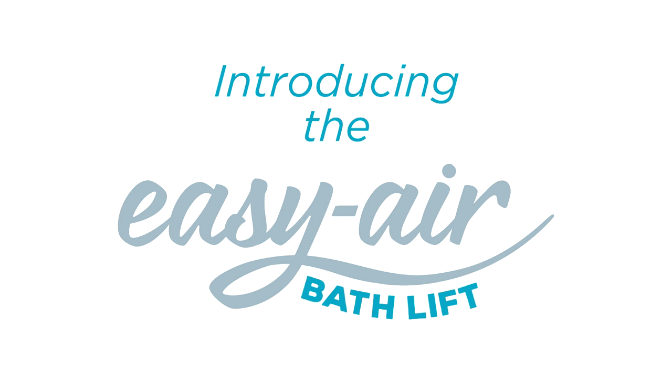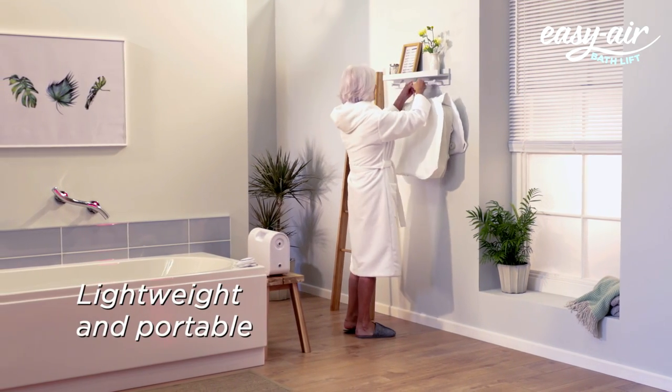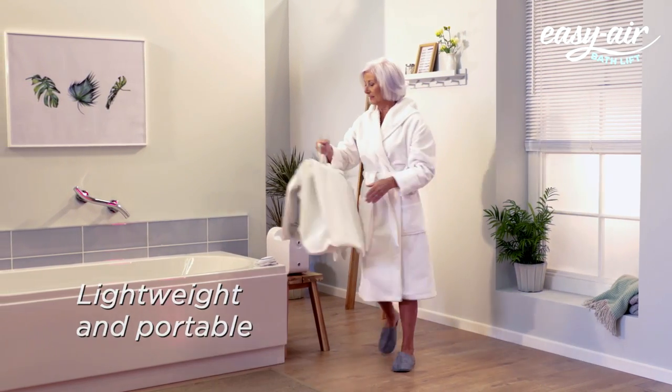The Better At Home Easy Air Bath Lift helps you get in and out of the bath independently in your own home. It's portable, lightweight and folds flat, so it can be easily stored away.